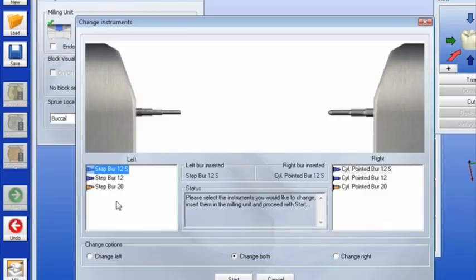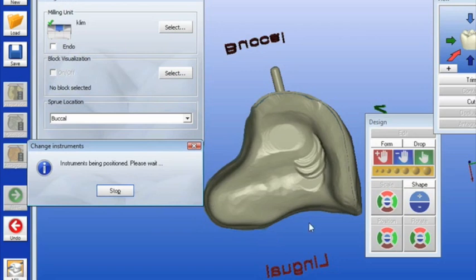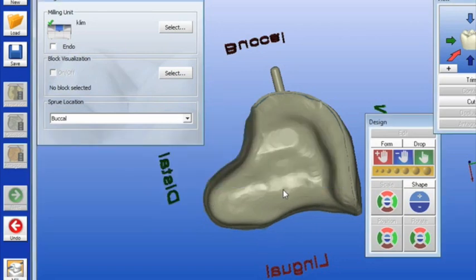You'll see on your screen right now — we're looking into our instrument window. There's the S-step burr, and look how much smaller the tip of that non-S-step burr is. That's almost a half a millimeter difference. Now look at the restoration: there's the S-step burr, there's the non-S-step burr. Do you see that pothole with the S-step burr?